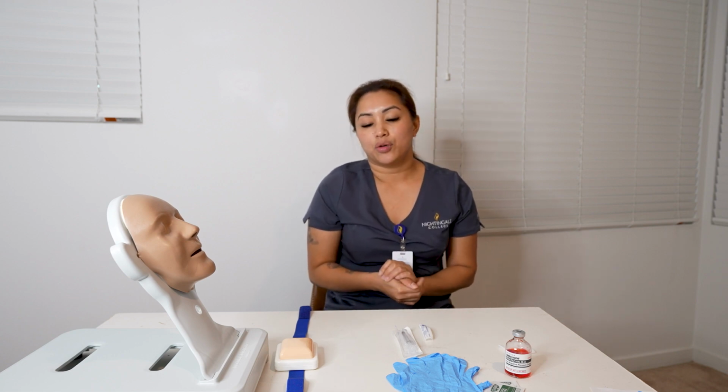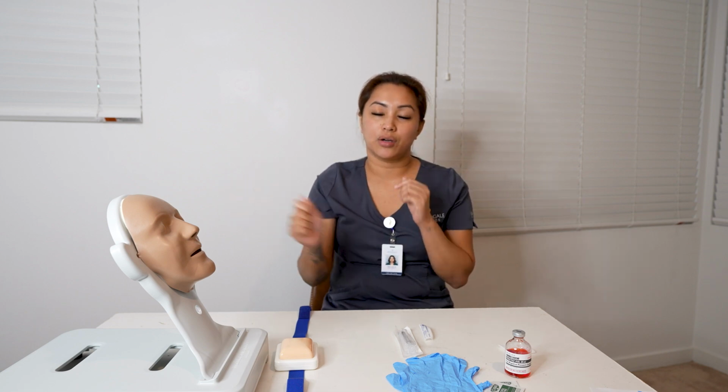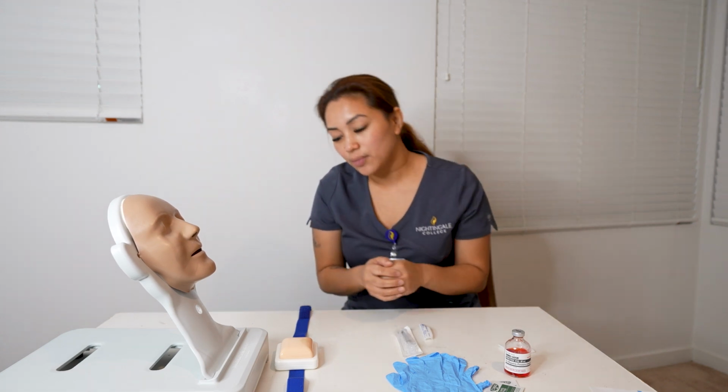So now I am going to grab all my supplies, walk to the patient's room, knock on the door, provide the privacy curtain, place these on a clean flat surface, and I'm going to wash my hands.